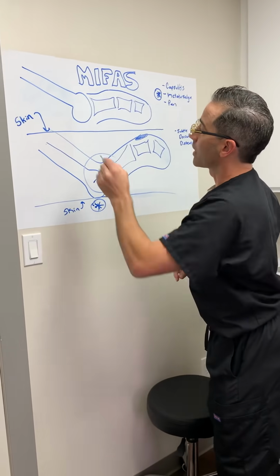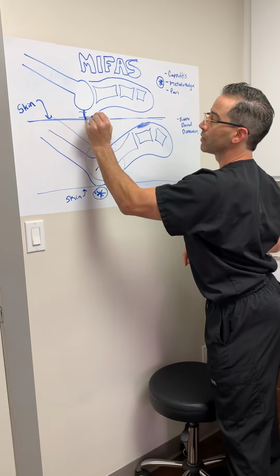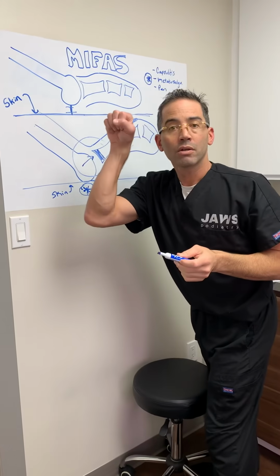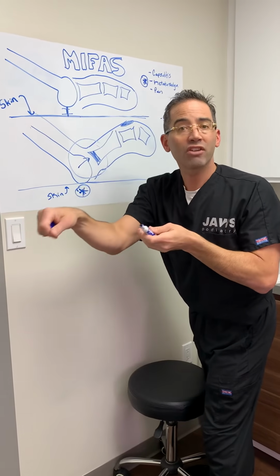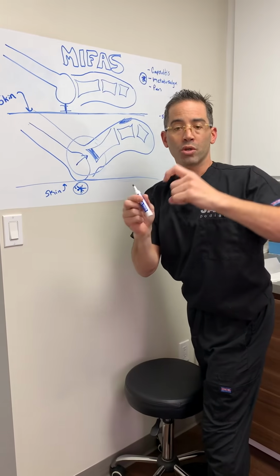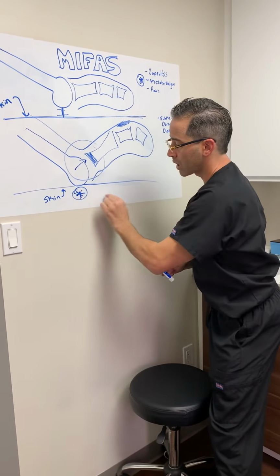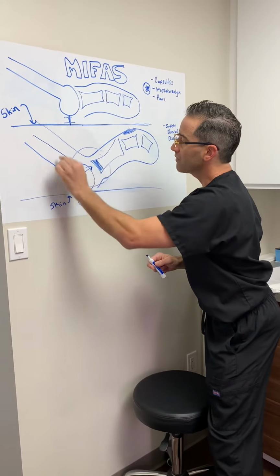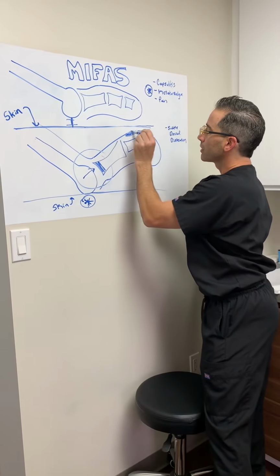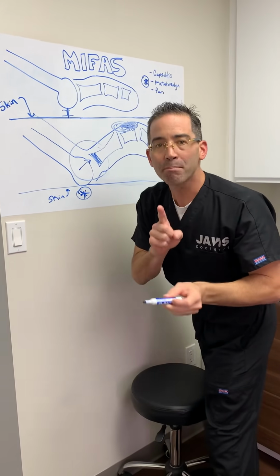After schematic diagram, we have the skin here. Now there's more space in between the metatarsal head and the skin, and the toe came down, right? And you guys will see it in the picture once I post everything. So he presented with a semi-rigid hammer toe deformity, pain on the bottom of the foot. We did the minimally invasive procedure, and this was the outcome. He did have a little, tiny little callus here, right? Just in this area. That did not bother him.